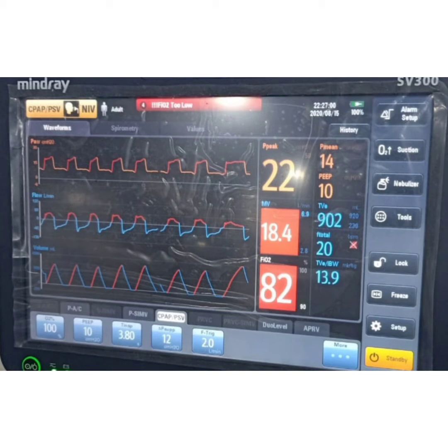The overall average of these two pressures over a total of 1 minute of respiration is called P mean. Just like we understand that mean arterial pressure is a combination of systolic and diastolic blood pressures, here it is a pressure during inspiration and pressure during expiration. If the average is taken, then it is the P mean.